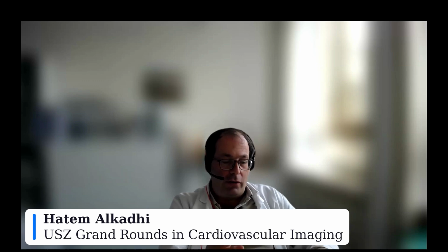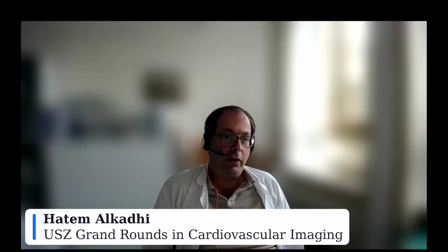Yeah, I fully agree with these questions. And this is not only true for photon counting CT. Of course, there is added complexity with all these energy levels and the increase in voxels that we have available for these small structures. But it's basically true for every scanner that we have. Every scanner is special in regards to its image reconstruction, its kernels, filters, slice thicknesses, line profiles.